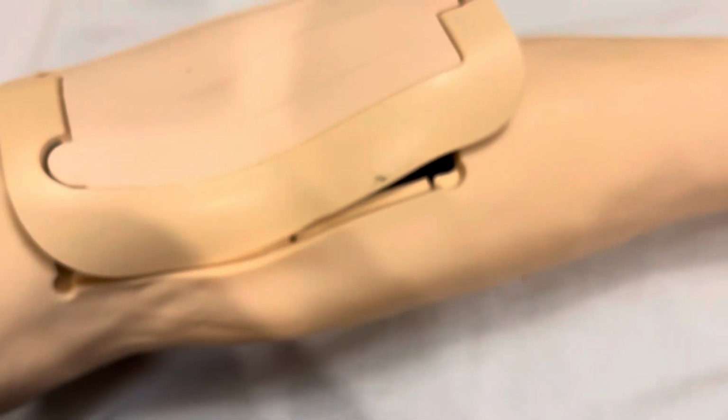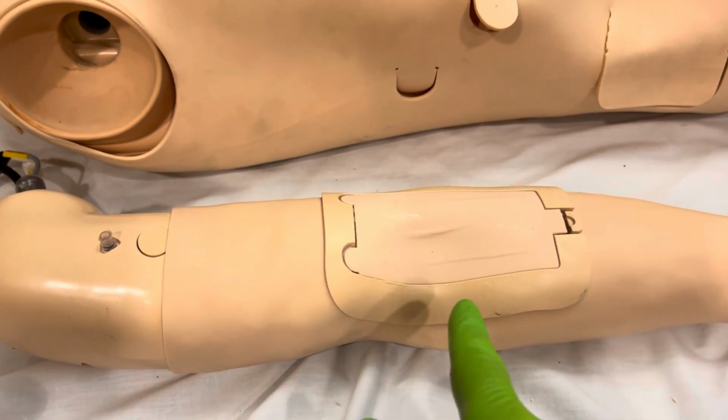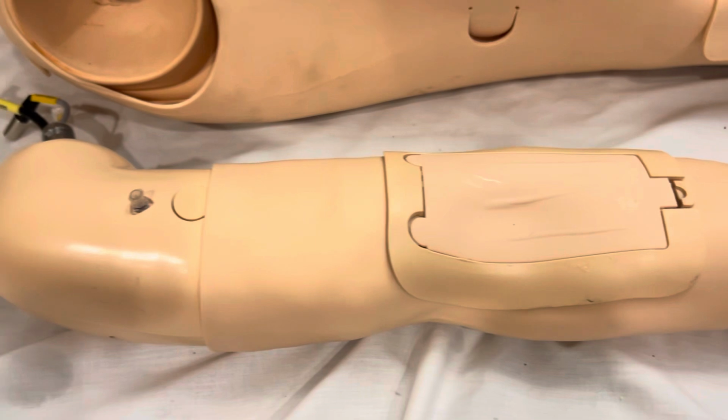Now I'm going to check to make sure I don't have any leaks in here. And it looks pretty dry. So now we can put this cap back on. All right, that thing is a little bit tricky to get on. Just make sure that your skin is properly aligned and not in the way of this clip here, but it is kind of a bear.